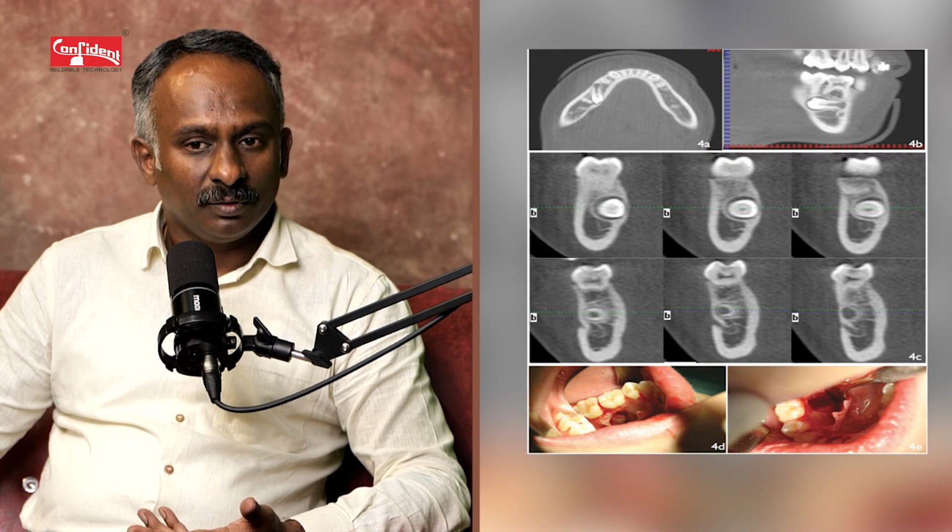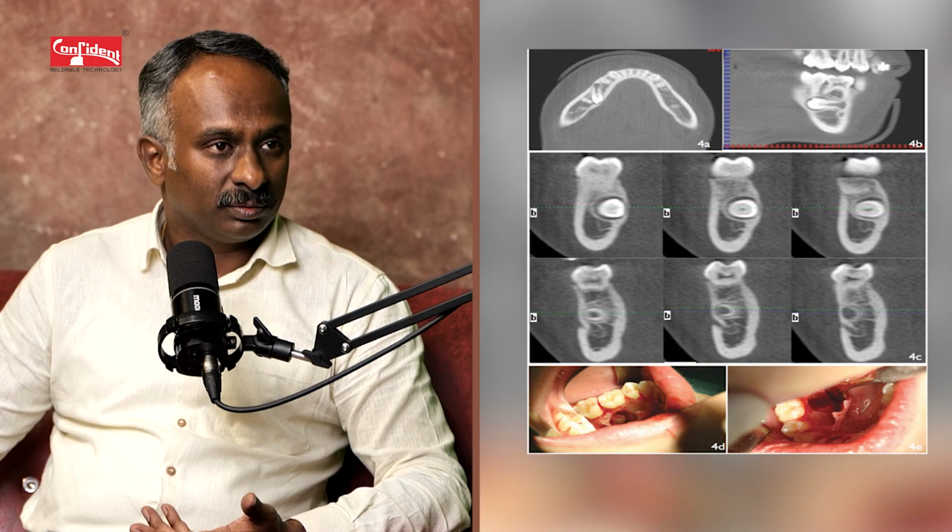For the assessment of the bone, if you want to see any osteomalacia or osteopenia, the mandible actually plays a major role in comparison to the other long bones, and this can be identified, which helps in treating the patients. Dr. Rakesh, wonderful. You basically covered almost all the departments of dentistry.